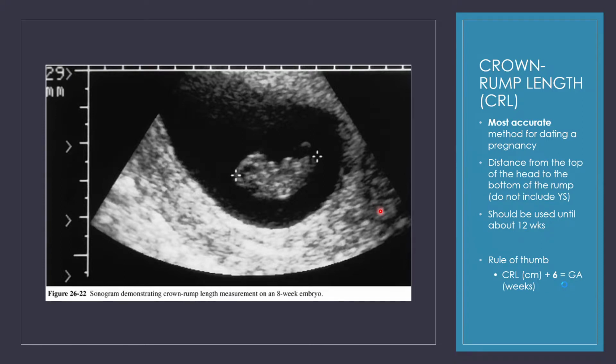And there's that 12 to 14 week time frame that is just kind of a difficult time to measure from a sonographer standpoint of view, because it's difficult to see the landmarks to do those other 4 measurements, the head circumference, abdominal, femur length, but it's too far along to do the crown rump. So you kind of hope that it's under 12 or over 14 when you have those clients come in.